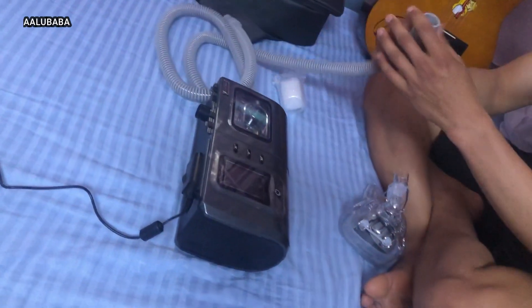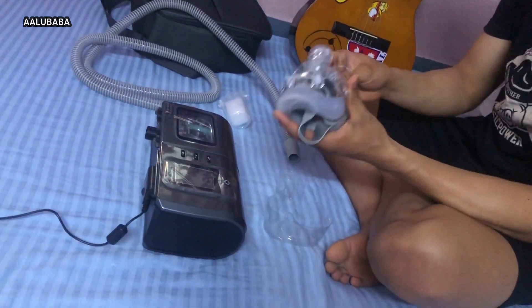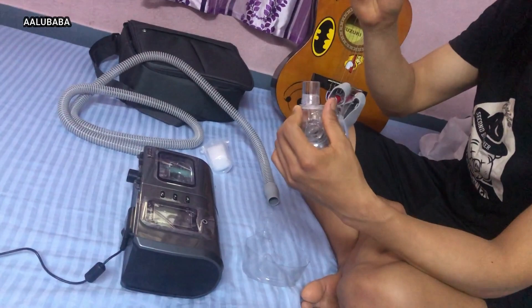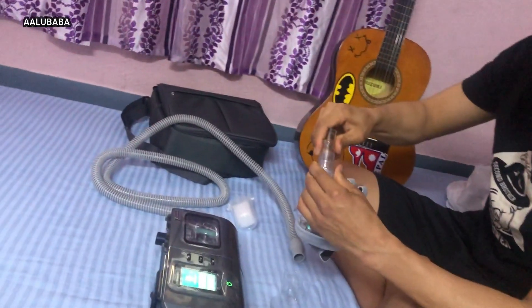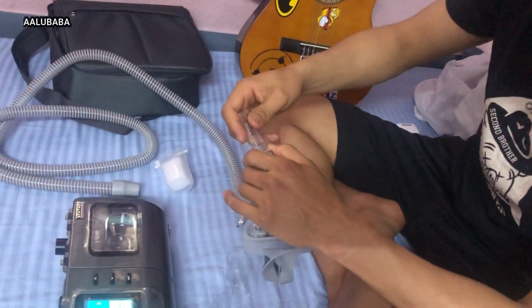This is a windpipe, so you can connect it with the face masks. You can connect them with each other, and you can use the pipe to make sure you check for any air leak.